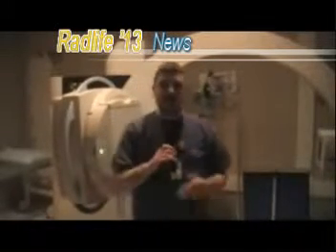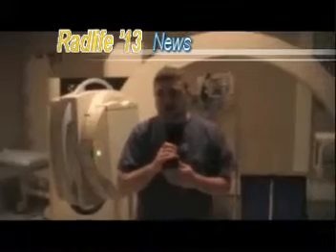I'm broadcasting live from the X-ray department at Grand Strand Regional Medical Center in room 2. Behind me we have the Swissray Indico 100 series high frequency generator. If you look to my left, we have the X-ray tube, and of course to my right is the X-ray bucky, and they are attached on a C-shaped arm, which is what makes this particular generator unique. I'm going to introduce to you the various control buttons on the tube and bucky on the Indico 100 series.